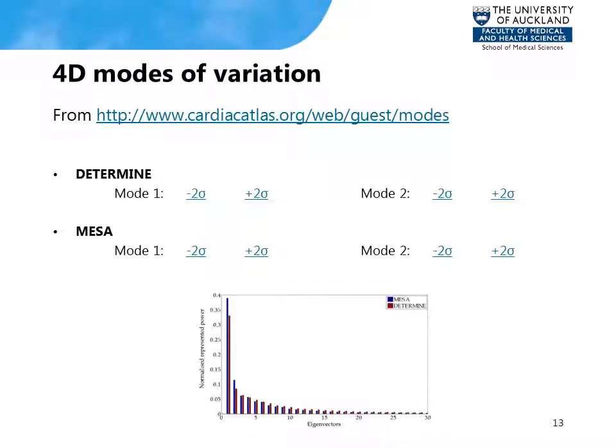Unfortunately, my PowerPoint crashes when I try to play too many animations at the same time, so these modes are animated online on our website, and I would like to invite you to explore the rest of the modes of variation. Sometimes it can be a challenge to label them, since when they lose power, the variations become subtle and more difficult to identify.